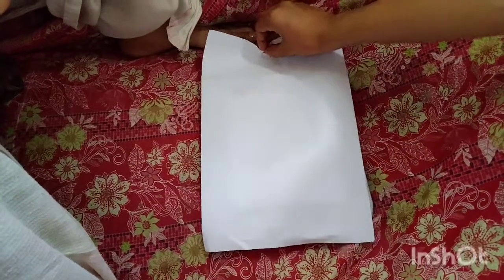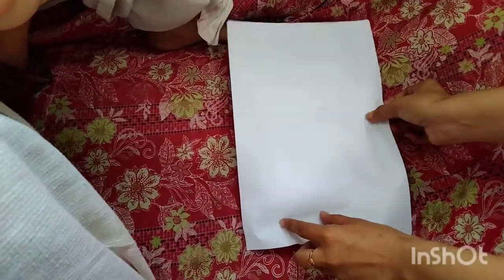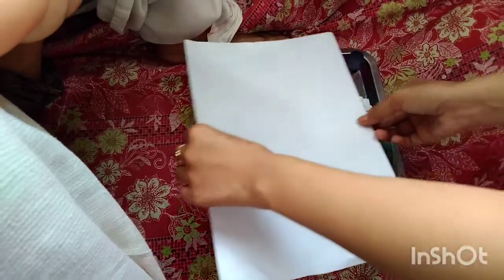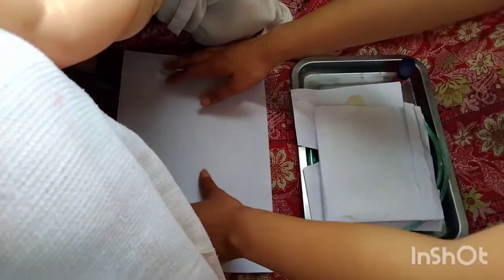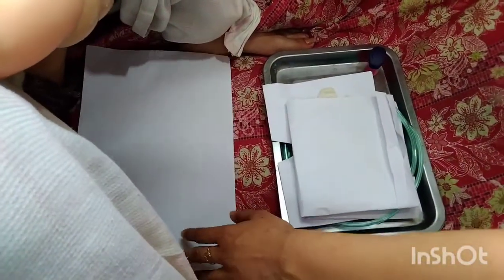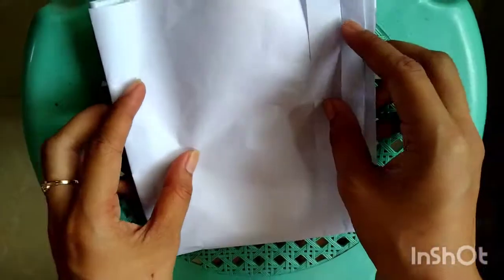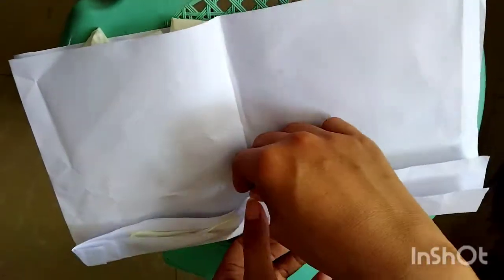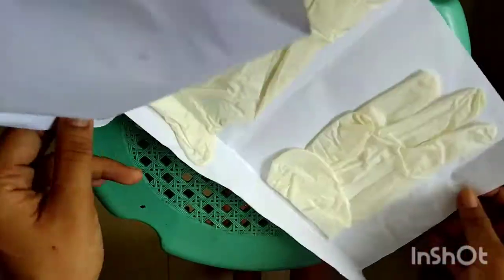Next, in opening the sterile pack. A. Grasp its corners and open it with care, touching only the underneath sides and edges. B. Bring edge of cover under buttocks if able. To provide sterile field and to prevent transmission of microorganisms from table or work area to sterile supplies. Next step is to let the doctor open the pack of sterile gloves to put on gloves. This allows doctor to handle sterile supplies without contamination.